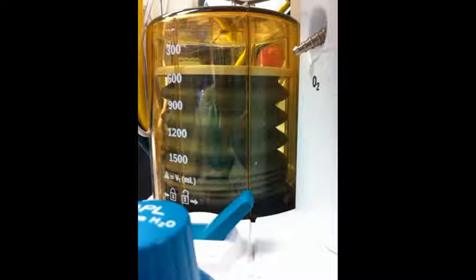Here is the bellows of the ventilator. This bellows must continuously go up and down during the case if you're doing controlled ventilation. This must be watched carefully. Directly in front of the bellows is a little green lever which can be switched from the left position into the right position.